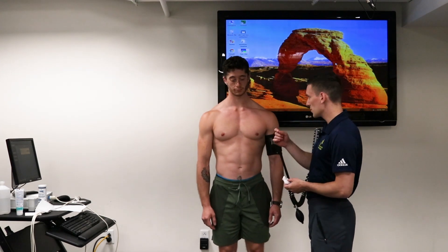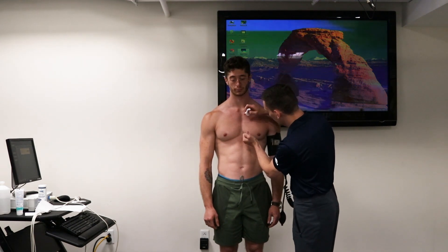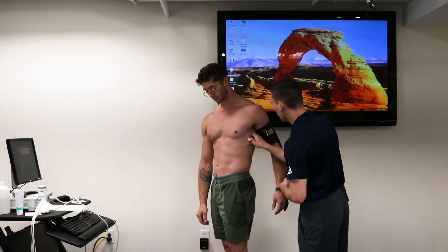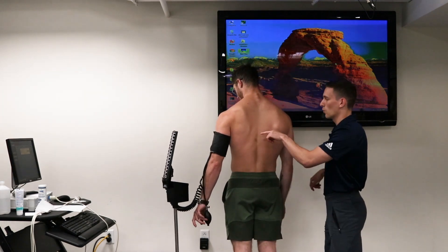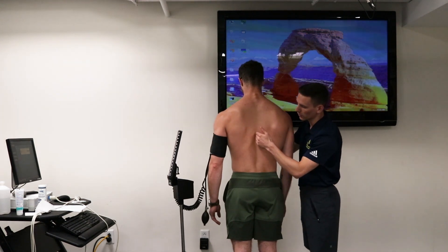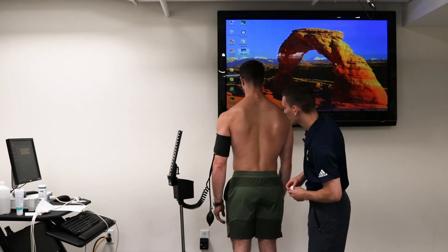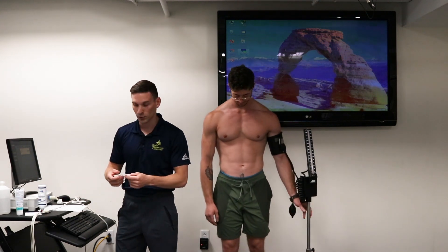You want to make sure you're pushing hard enough — the skin should get a little bit red, and even further so with the new prep. We're going to find the middle of the sternum and wipe that down. Now V6 — wipe that down. Then we'll come to the back and find what's in line with his xiphoid process. One hand on the front, one hand on the back where the xiphoid process is, and shift slightly over to the left to avoid placing leads directly on the spine. Give that a nice wipe and turn back around.